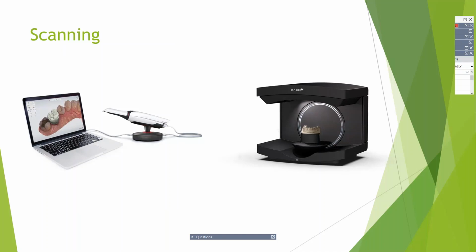First, let's talk about some different scanning options. So really, we've got two main options here to actually gather our data that's necessary for producing these splints. The first is going to be an intraoral scanner. So you absolutely can receive scan files from an intraoral scanner and import those and use those to produce your splint. The second option is going to be a desktop scanner like the 3Shape E4, E3, or the 3Shape E series. Is also the other preferred method for receiving these scans.